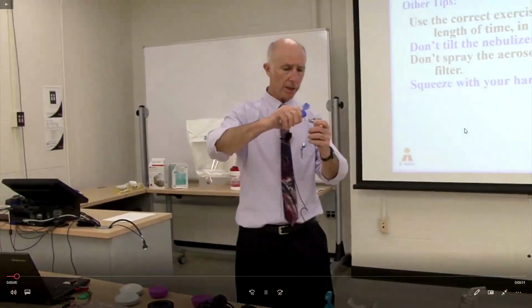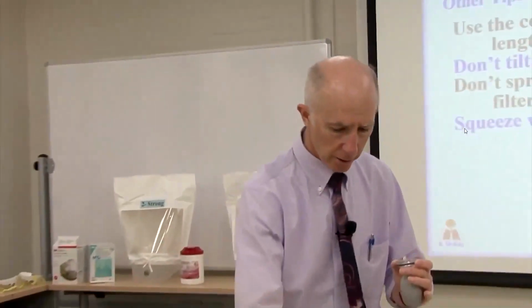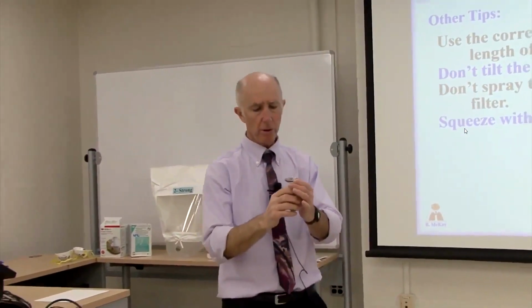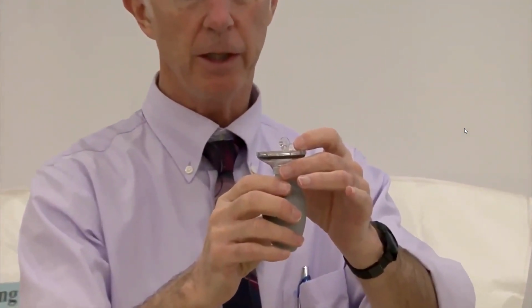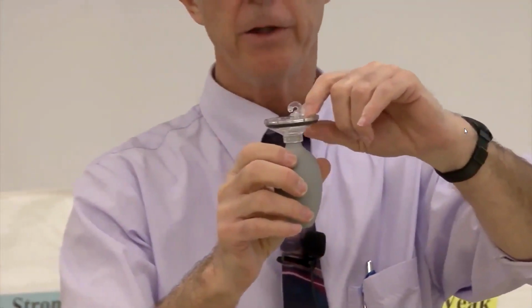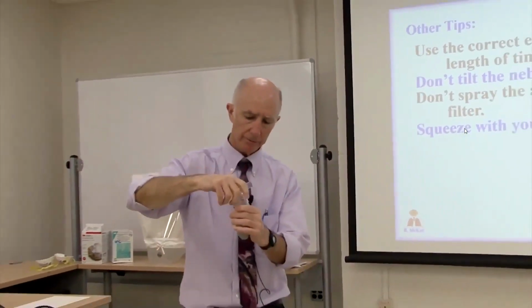You take the nebulizer here, put a little bit of solution back in it, and this is particularly true when you get towards the end of the test and there's less liquid in there. So there's a pickup on this jet. And if I tilt the nebulizer excessively, I'm going to go ahead and just put the cover on.